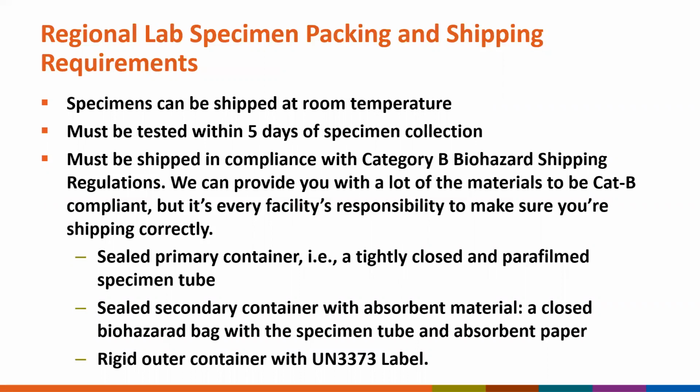So for some packing and shipping requirements, these are specific to regional labs. Different labs may have different requirements, but specimens can be shipped at room temperature, and they must be tested within 5 days of specimen collection. So if you collect on a Monday, we need to have that specimen and test it before Friday. If you send it the next week, we will have to reject it.